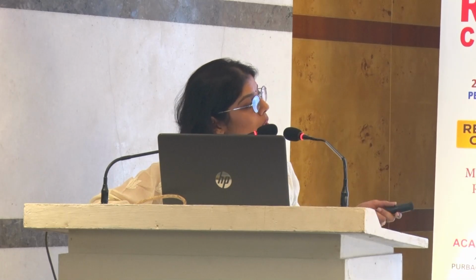This was sole pain. We can see that this is the plantar fascia. It's quite thickened over here. It was around 13 millimeter in this case.